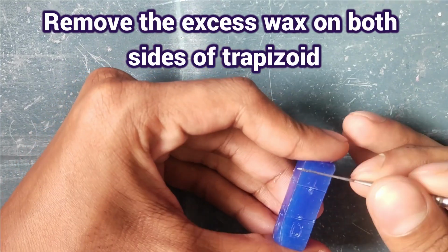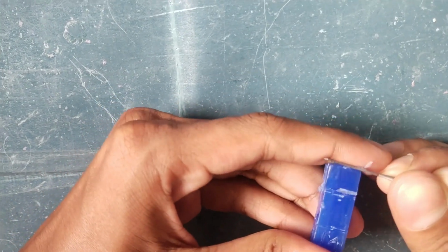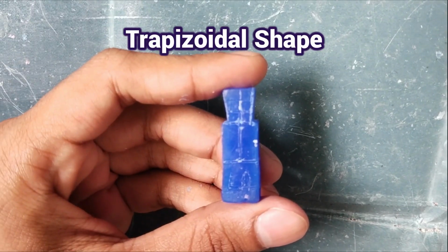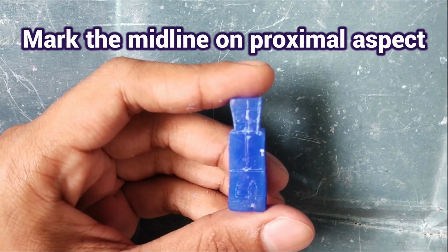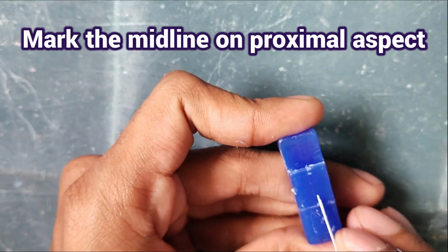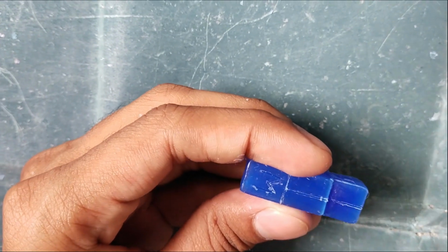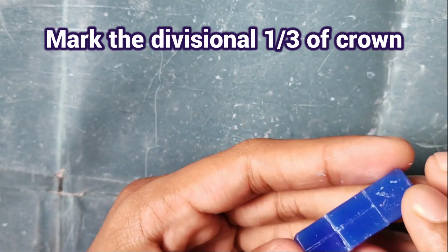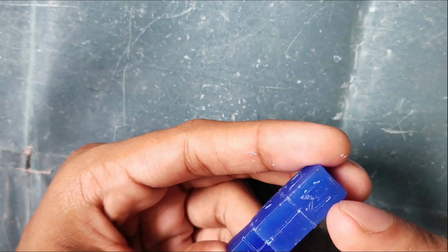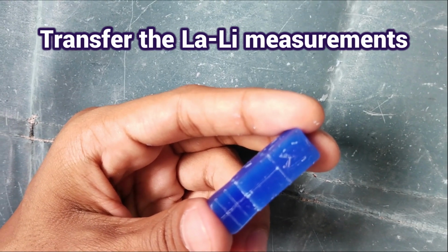Carve the axis. Achieve the trapezoid shape. Now mark the midline on the proximal aspect. Now again divide the crown into the thirds. Now transfer the labiolingual measurement.